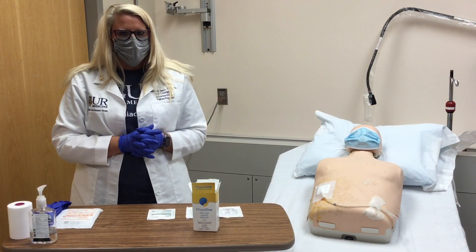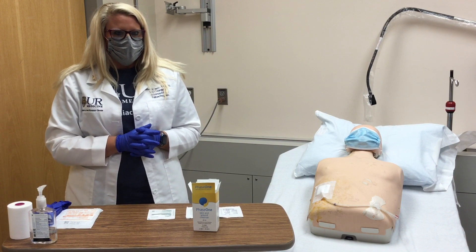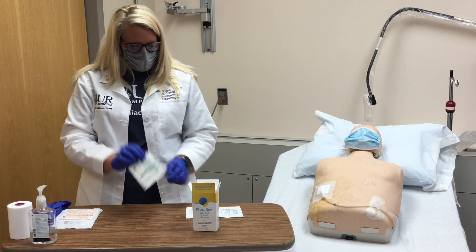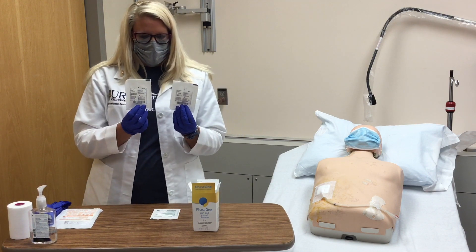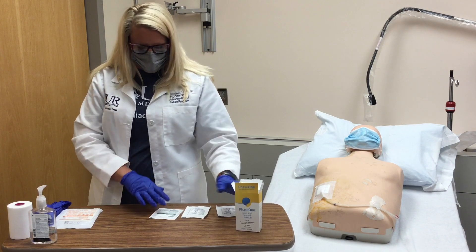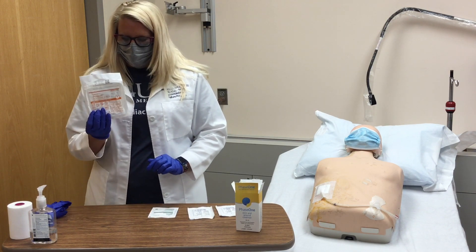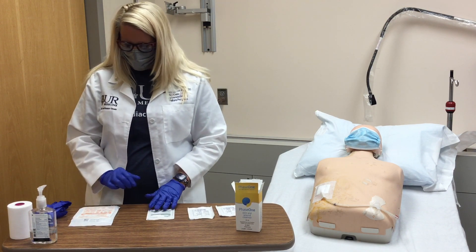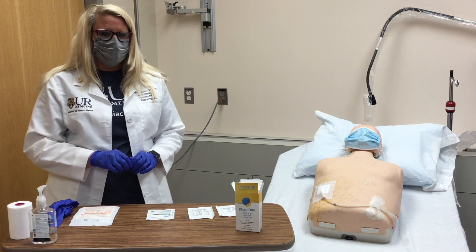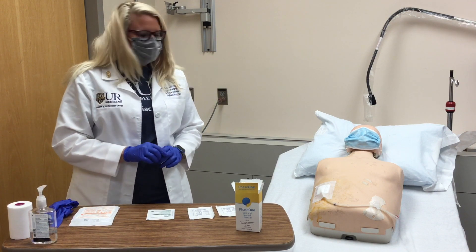Next we're going to gather our supplies. We are going to need one split gauze packet, two gauze pad packets, one bottle of Phase One, a pair of sterile gloves, also a pair of non-sterile gloves, masks for yourself and the patient, and a roll of Medipore tape.